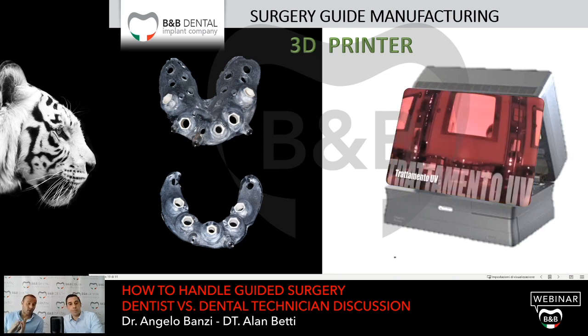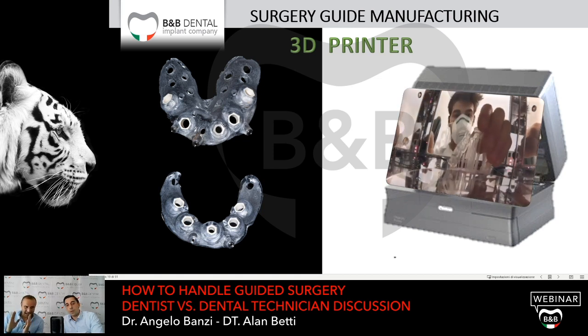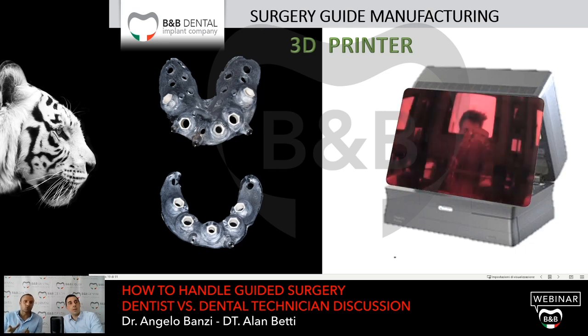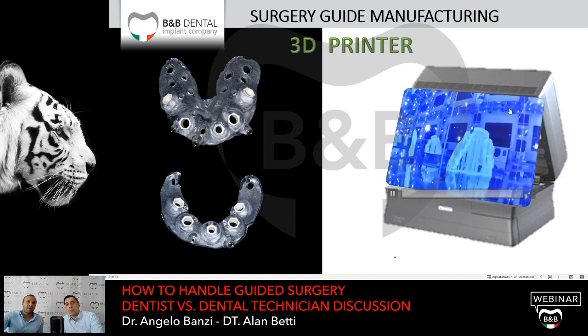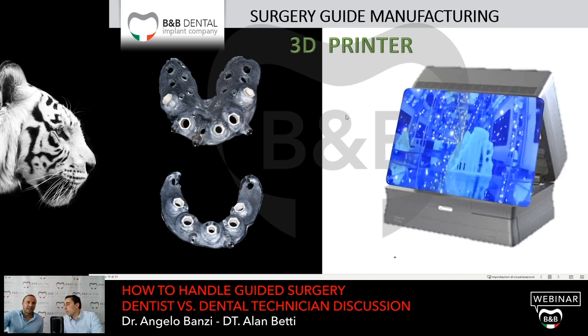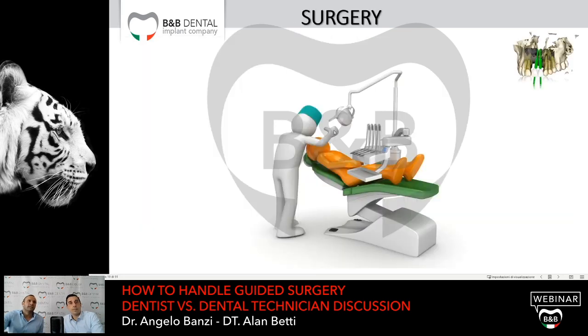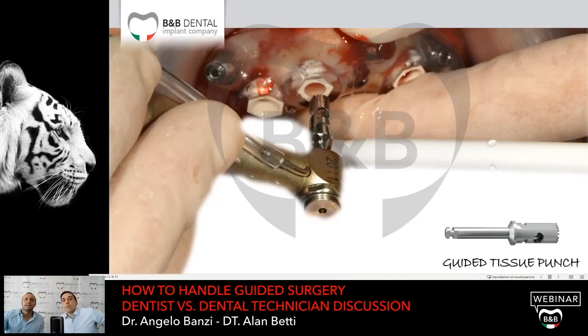When I say precise, I mean that it's identical or much more identical to the virtual surgical template that we have planned with the case, with the software, the CAD. Okay, so let's move on with the surgery. Very easy, and fast.